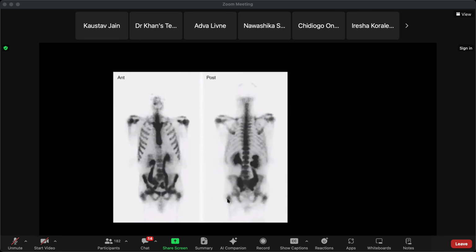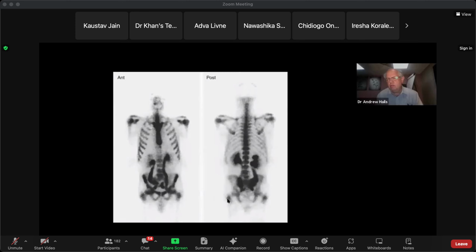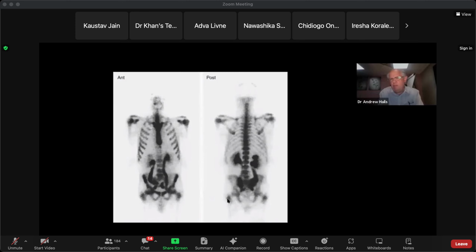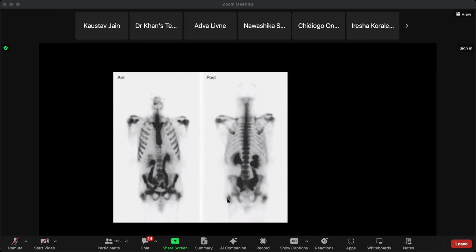There could be two different diagnoses going on at that point as well. Does this image really suggest hyperparathyroidism? You mentioned hyperparathyroidism. Why do you think this might signify hyperparathyroidism? I was just trying to see how the bony involvement and the kidney involvement can come together, and that's the only logic behind it. I can't be completely wrong though.